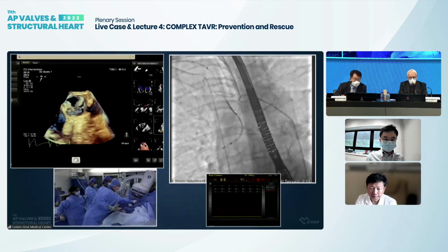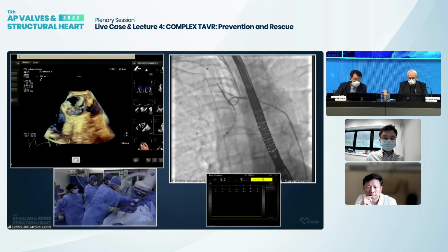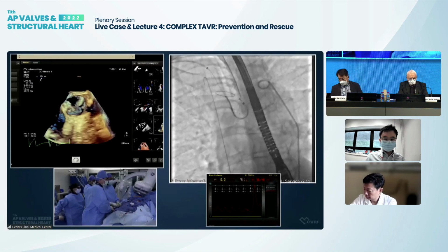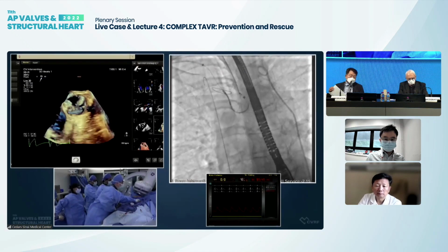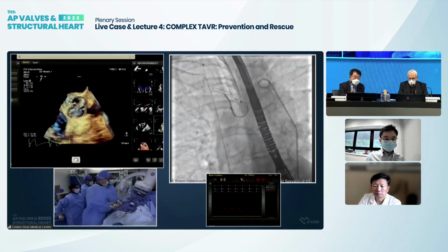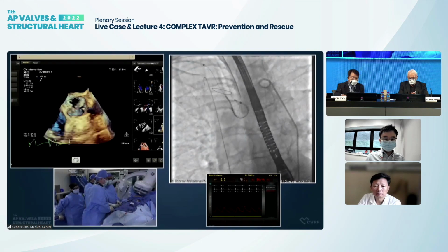The first most important one, we have very, very heavily calcified anatomy and a choice of valve. We have been discussing this yesterday here. Can you bring us a little bit closer to your thoughts on why using S3 versus a balloon expandable? So, I'm sorry, self-expanding. Yes. So I think what we feel is that you should use the valve that you're most comfortable with.